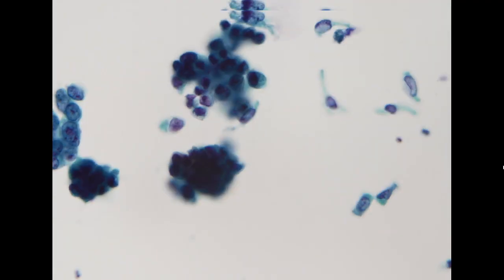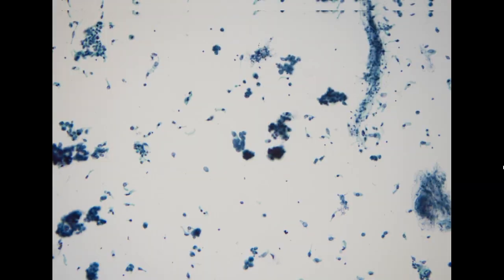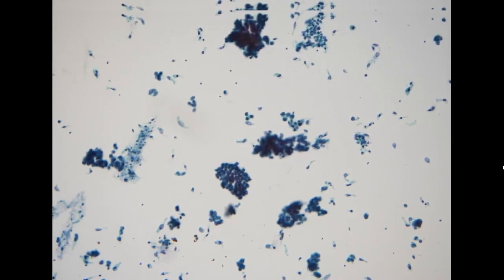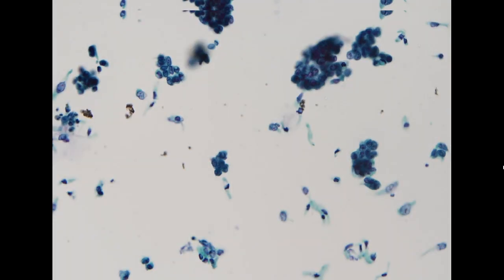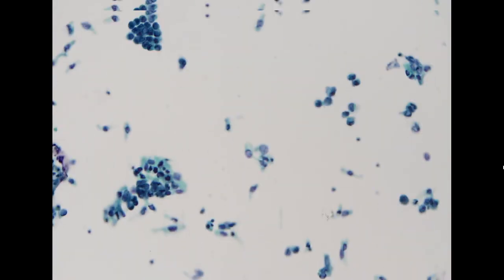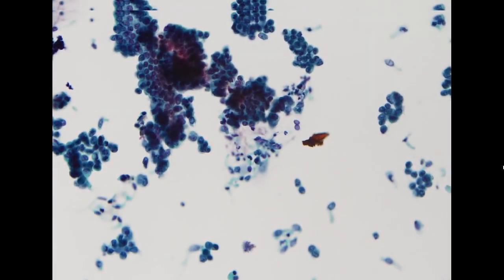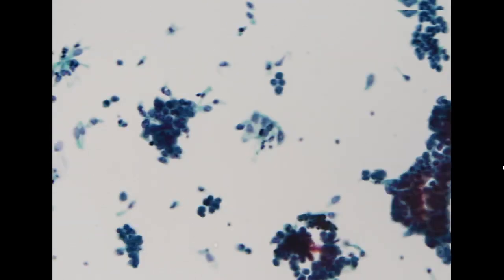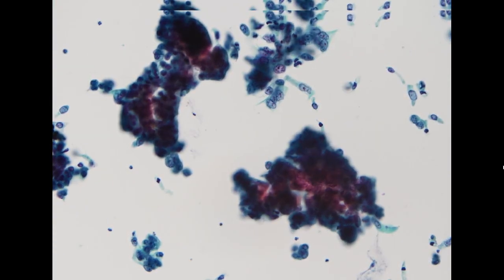For the washing cytology specimen, sometimes it is a little bit difficult because we will see a lot of fragments and it is hard to see through. However, for this specimen it is kind of easy because you can easily appreciate the high-grade nuclear atypia of these urothelial cells, and these are throughout the entire specimen. So this is positive for high-grade urothelial carcinoma.